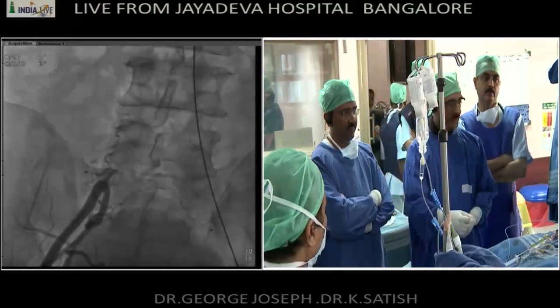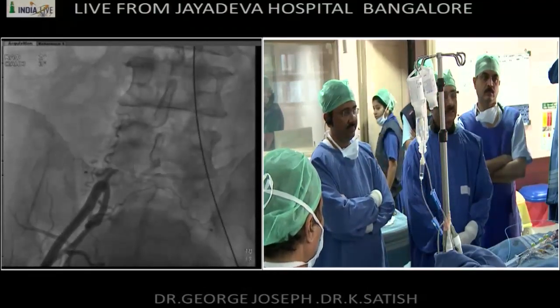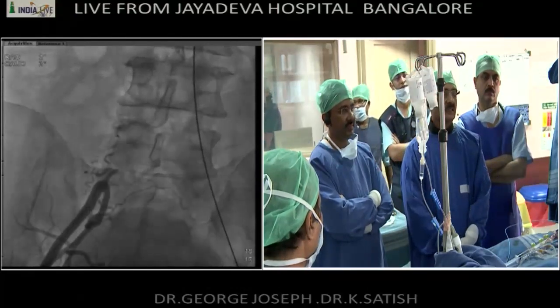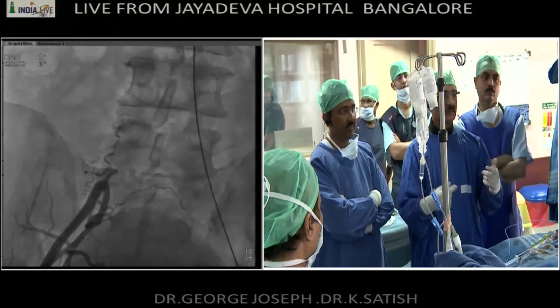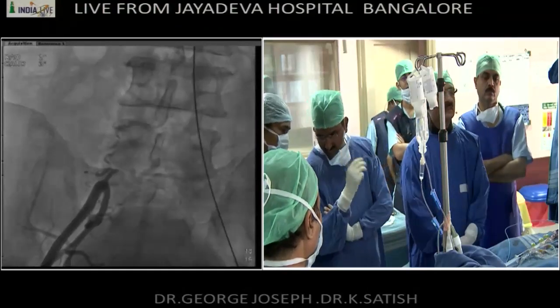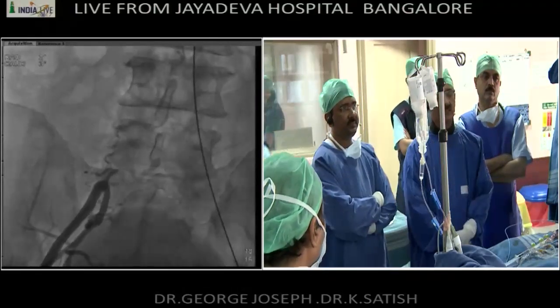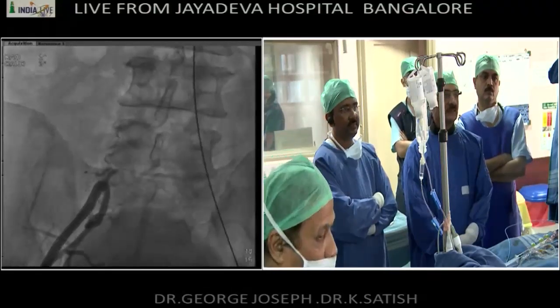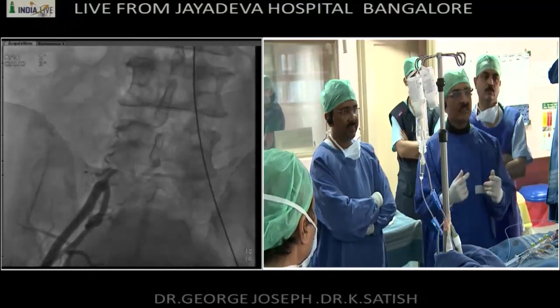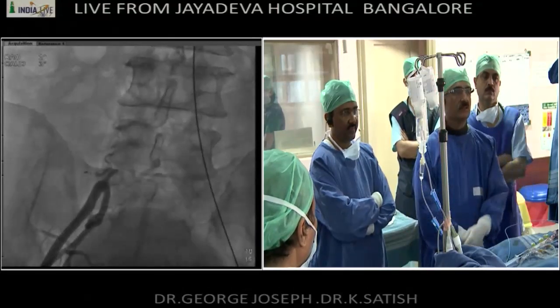So I'm going to use that and go up from below, and similarly if I were coming from above, I would use the same wire. If these wires tend to go subintimal, then I will switch to 018 or 014 penetration wires, CTO wires, to cross from one side to the other. But I prefer to do that crossing inside the CTO rather than above or below.